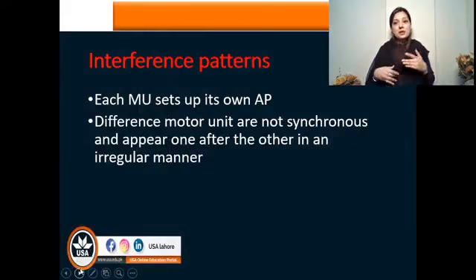Now we are going to move towards the next phase. Initially we looked at the behaviors of the muscle when it is at rest. Now we're going to see the behaviors when a muscle performs an action. For this, we need to understand some simple terms first. That comes in the way we discuss the volitional activity of a muscle. Volitional EMG is when the muscle shows its activity, the movement pattern, the activity behavior of the muscle.